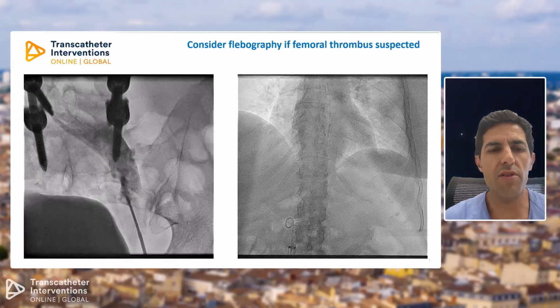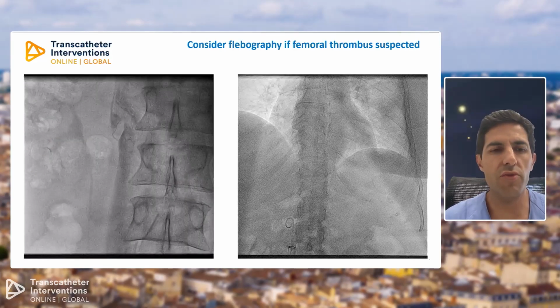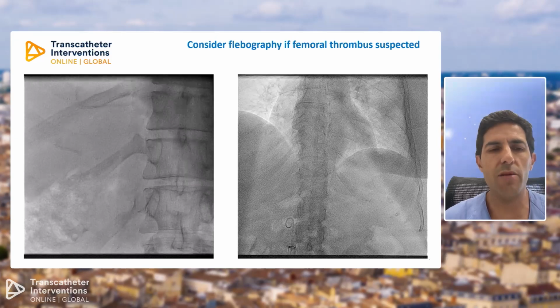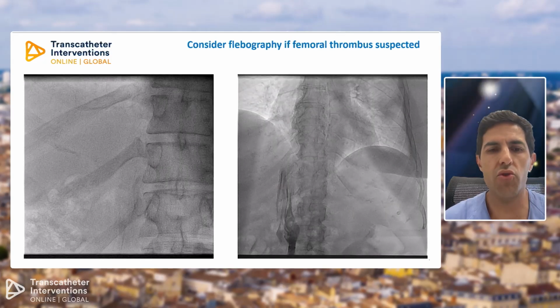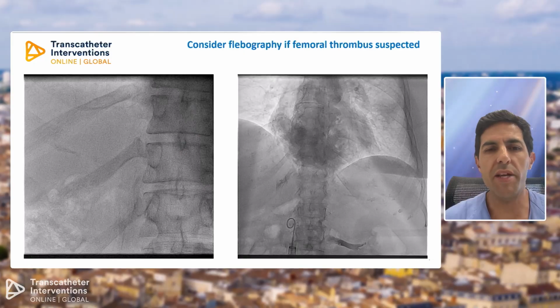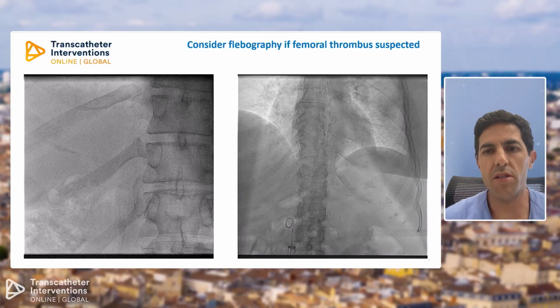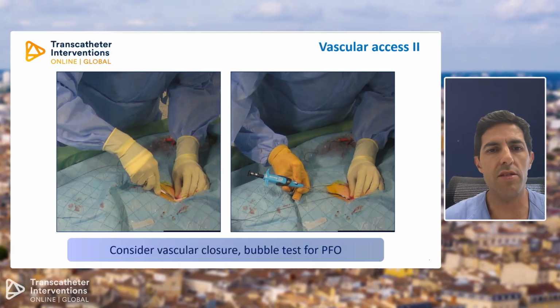So you can do, for example, this case had thrombus at the right iliac vein, so we went to the left, and we did an angiogram to check if there was remaining thrombus, because you could decide to aspirate this thrombus from the beginning, from the entry sheath. Okay, so you can. This is optional, but this is something that in some cases is useful.